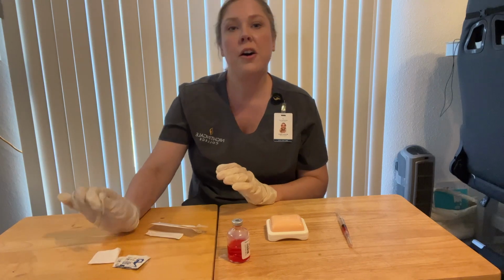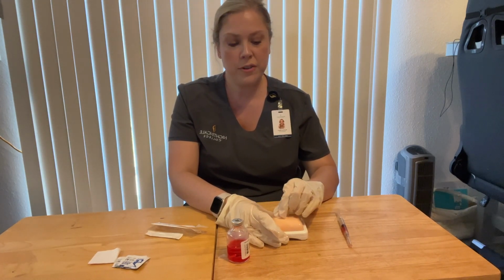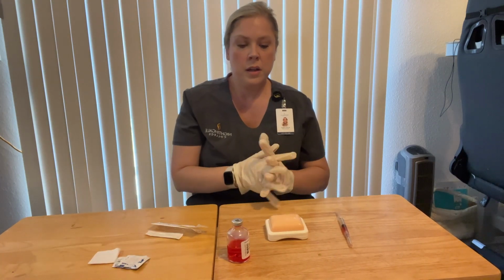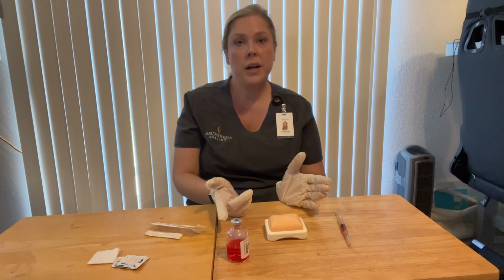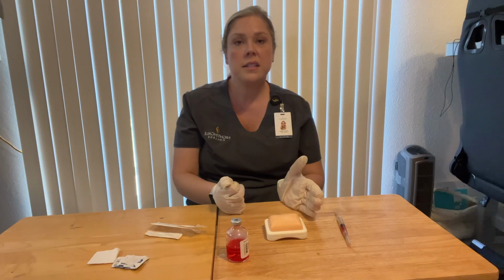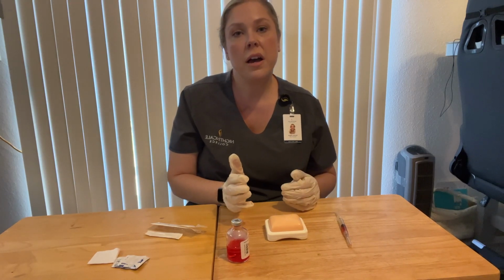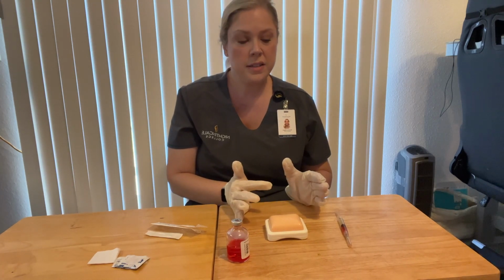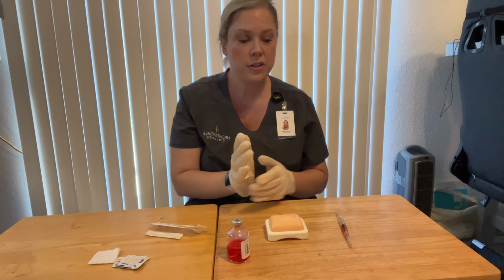Then we would grab our alcohol prep pad and go ahead and clean in a circular motion from the inside to the outside, about 5 centimeters. We'd want to let that site that we just cleaned air dry. We do not want to blow on it or fan the area with our hands. So once that site is dry, with our non-dominant hand, we want to use our thumb and the forefinger to spread the skin tightly, placing the ulnar side of our hand below and grasp for traction.